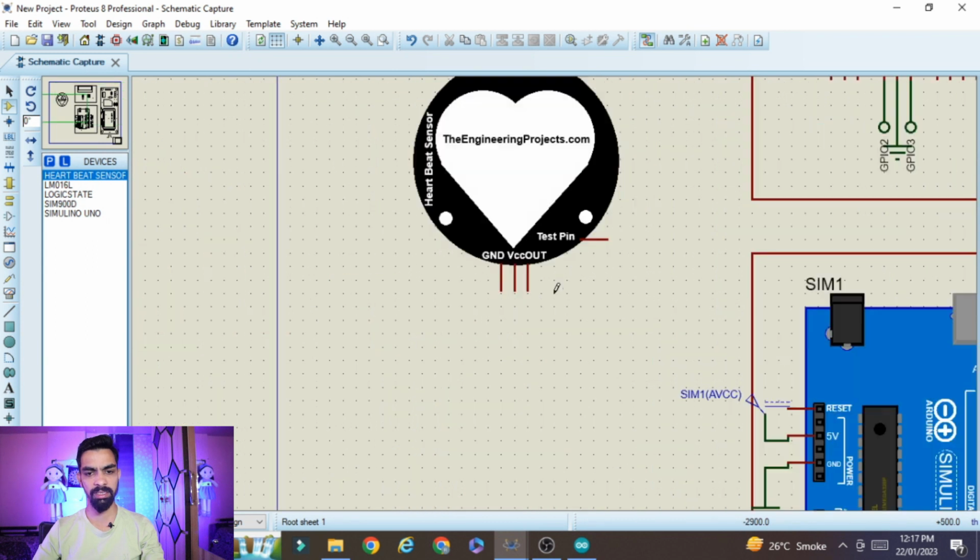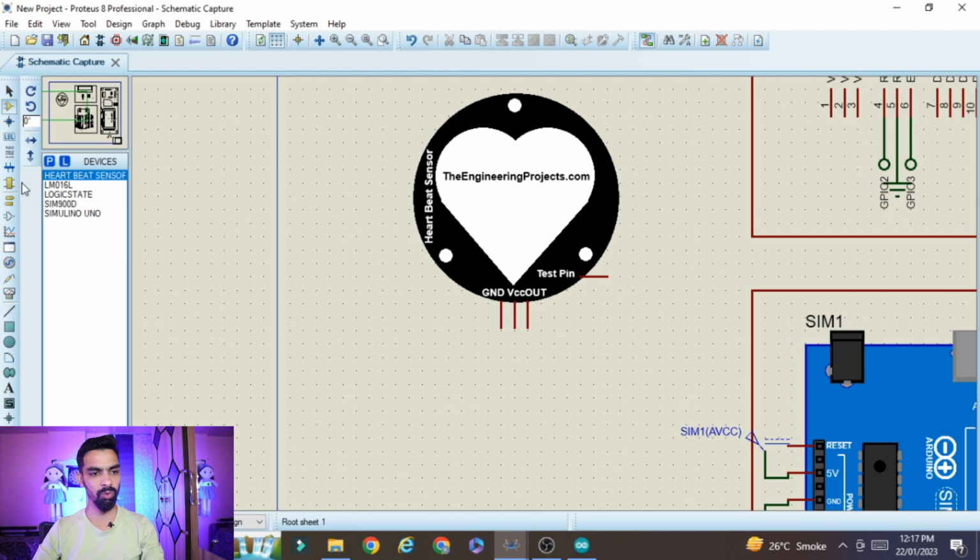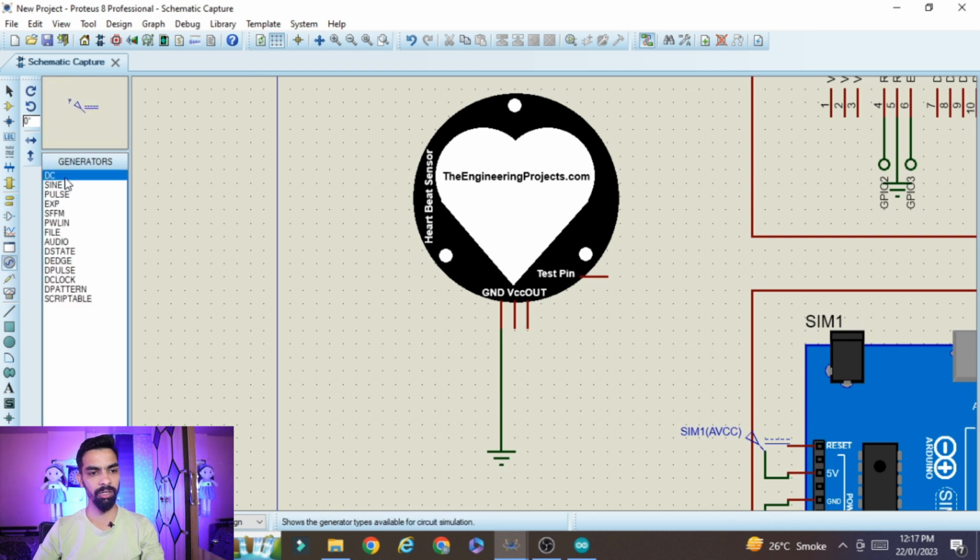Once you place that sensor, the connection is very easy. First, you connect ground to ground. So go to the terminal mode, click on ground, place the ground here, and connect this ground pin to ground. Then again VCC, you need a VCC supply. So go to generator mode, click on DC supply, place the DC supply here, and connect the DC supply to this pin.